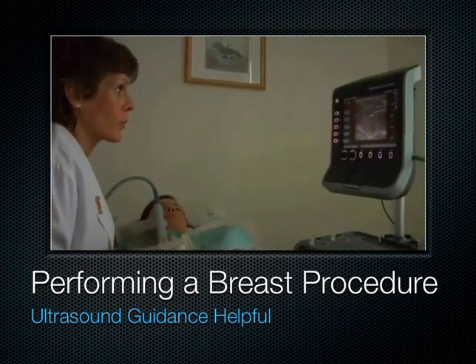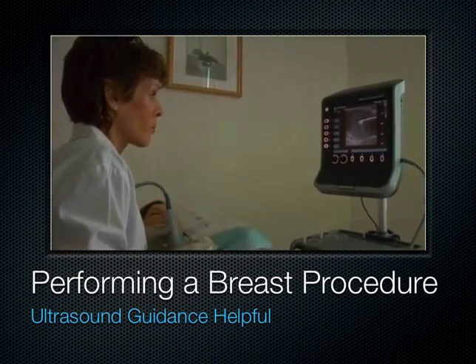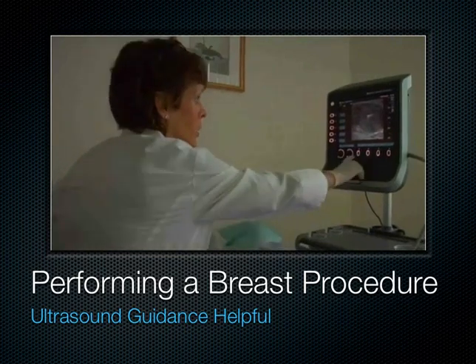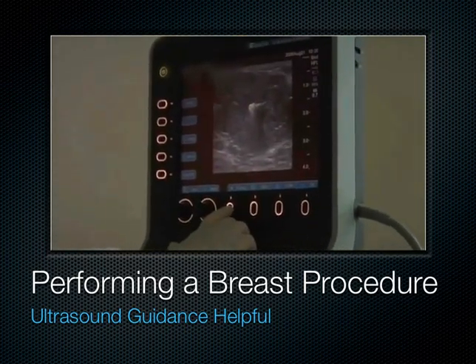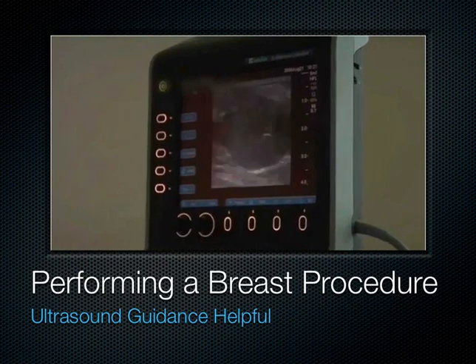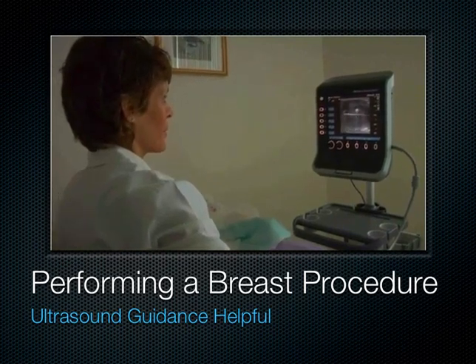This is actually a step we don't always do. In fact, if I've done the core biopsy, this is already done. It's pretty standard when you do biopsies on things to leave a marker in place, and especially with this procedure, because eventually the goal is going to be that the fibroadenoma goes away. We want basically a record on our subsequent mammograms and images where it was. Okay, go ahead and get started.